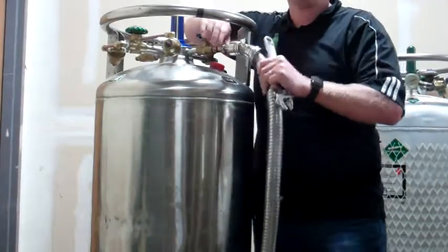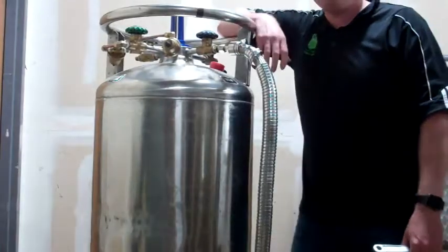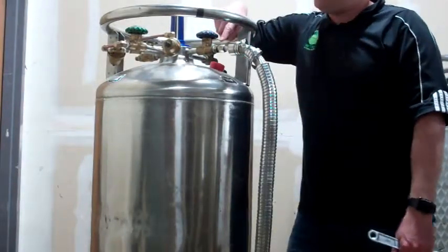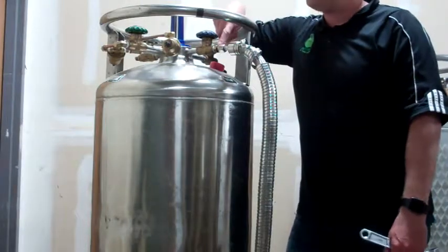Remember, brass is malleable — it's softer than stainless steel. So when you're putting it on at an angle it will strip this fitting.